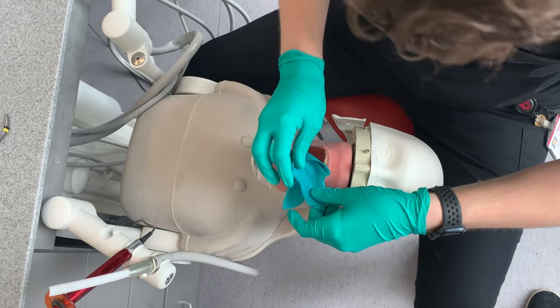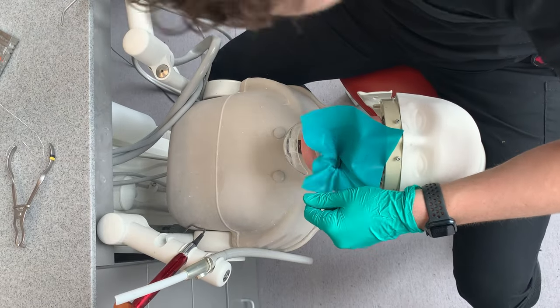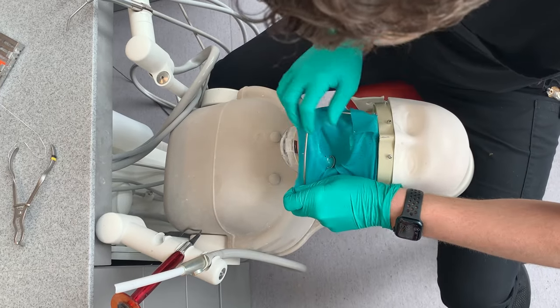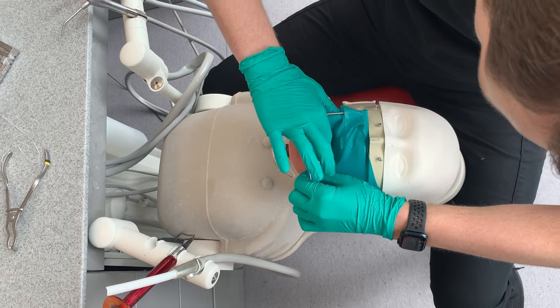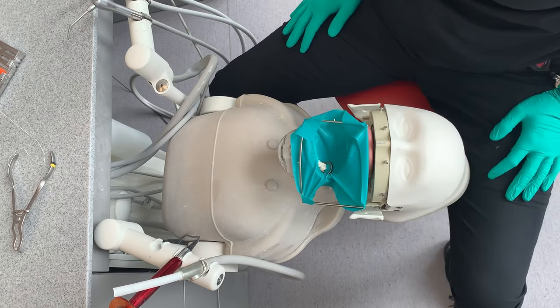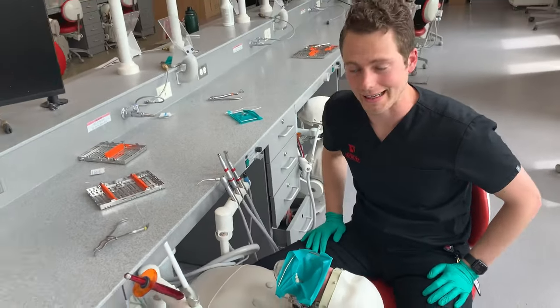Then you can just reflect it down. At this point I normally like to have my frame on because it just makes it a lot easier. Now I can position it on the teeth. So that's the second method with a wingless clamp.